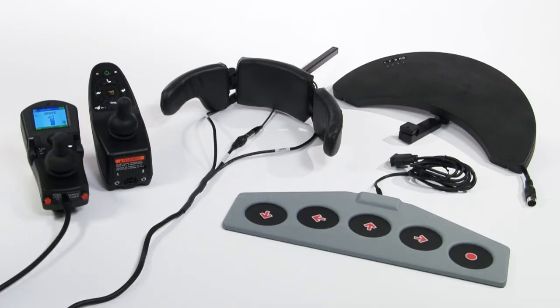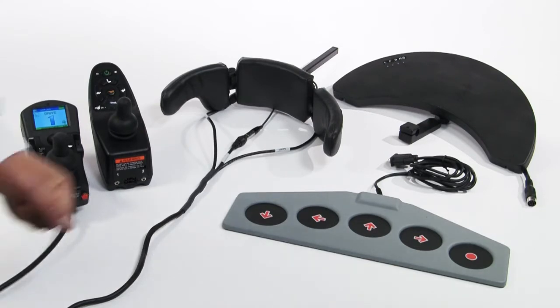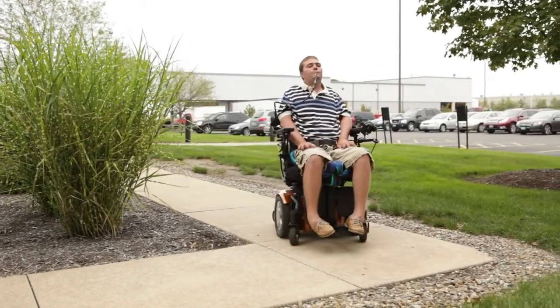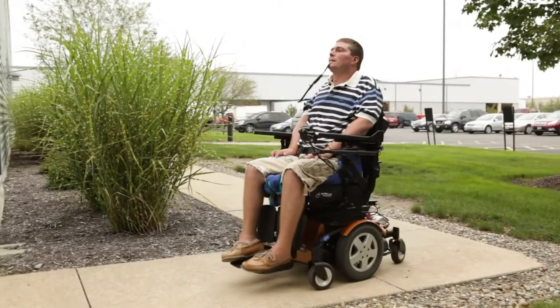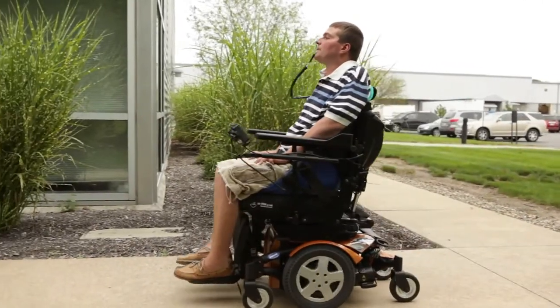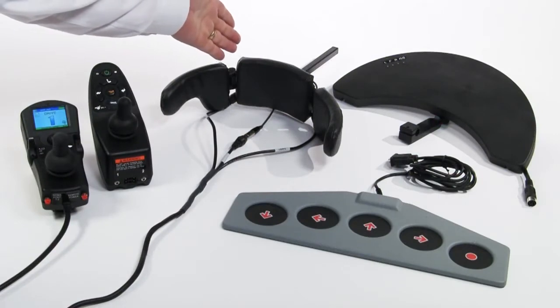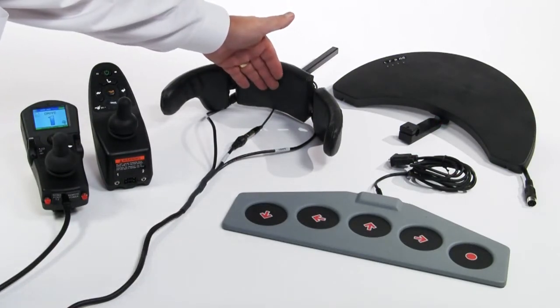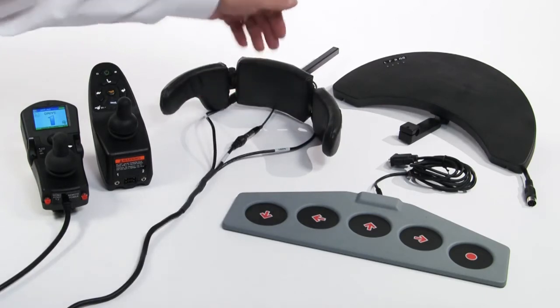Driving directions with the digital control are very discrete, very defined, either forward or left or right. 2 switches, such as forward and right, can be pressed at the same time to drive off in a veer direction. This is very helpful when using driver controls such as an ASL switch head array, closing the forward and right switches to drive off in a veer direction.